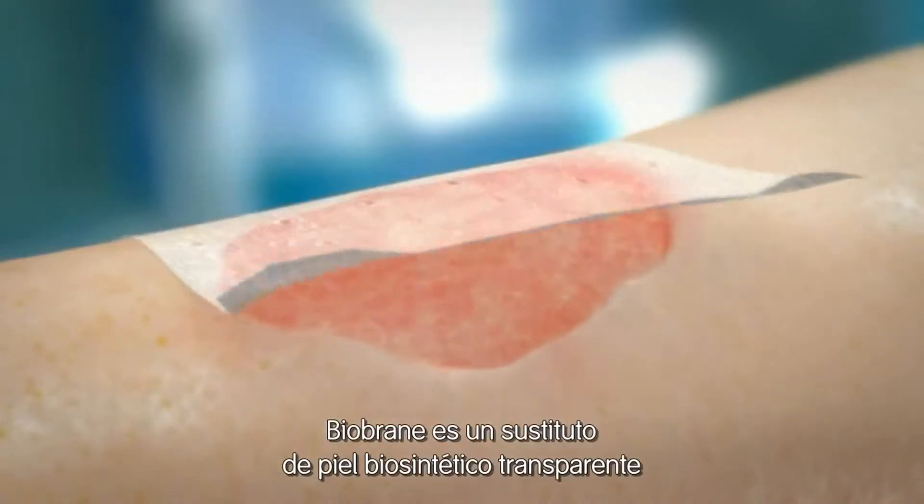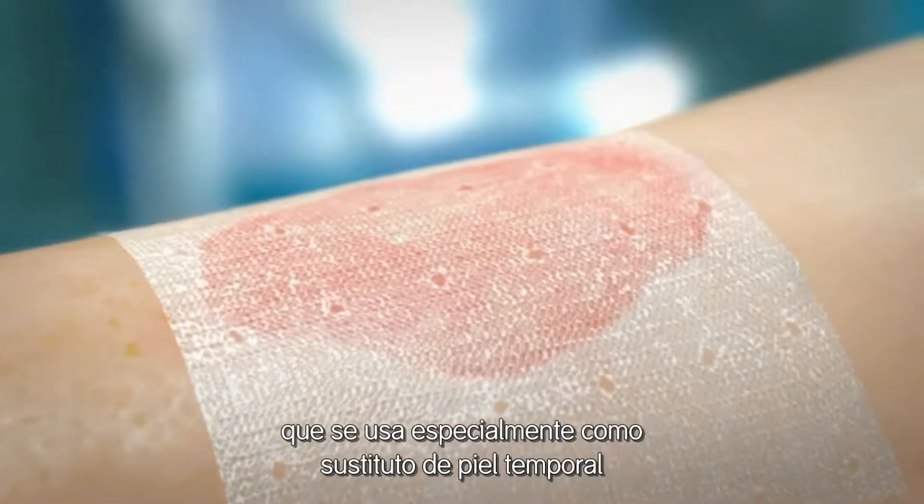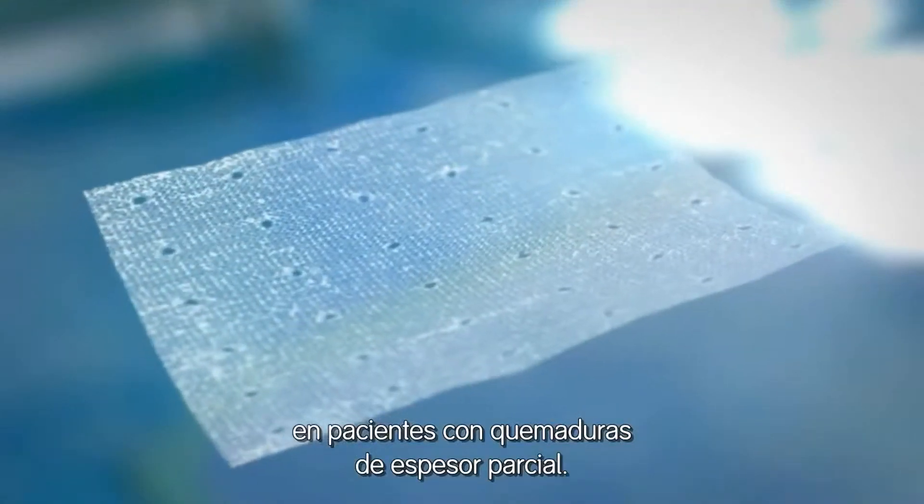Biobrane is a transparent biosynthetic wound dressing and is used as a temporary skin substitute for patients with predominantly partial thickness wounds.